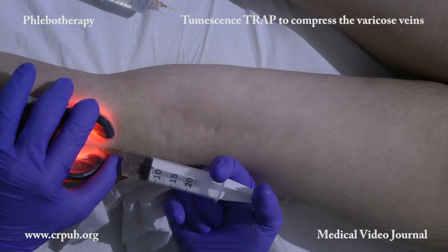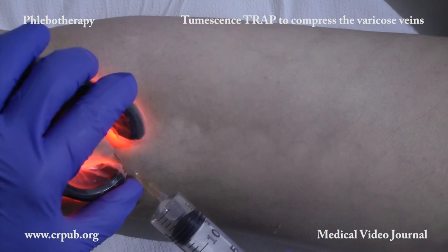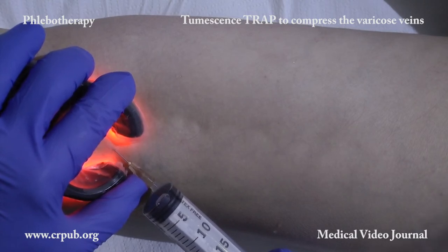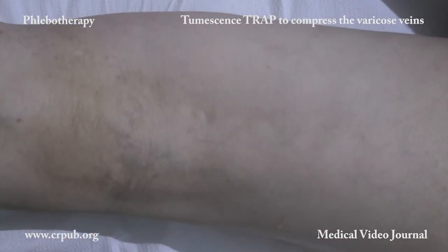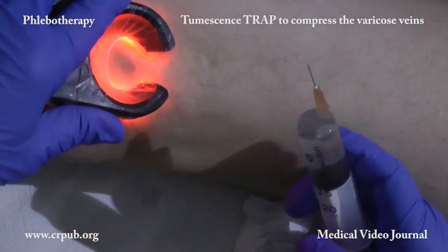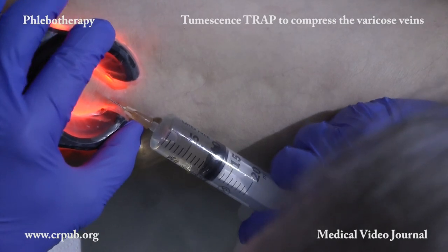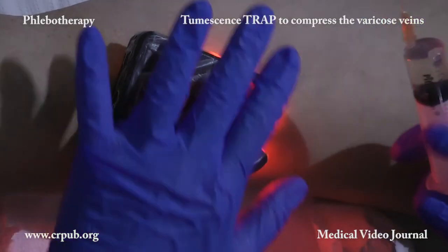Up to 12ml can be injected per single injection. Injecting small amounts of solution is not efficacious, as the solution needs to reach the deep veins within a short time in order to act on the entire internal surface of the perforating vessels. Moreover, injection must be rapid. The regenerative solution reaches the sites where it is needed — the most dilated and most dilatable veins. Following treatment, the regenerated veins become continent. The valves function once again and prevent backflow. The hemodynamic hypertension is corrected and the hydrostatic thrust, which causes the sensation of heaviness in the legs, normalizes. All this is achieved without losing the elasticity of the vessels, which disappear from view.